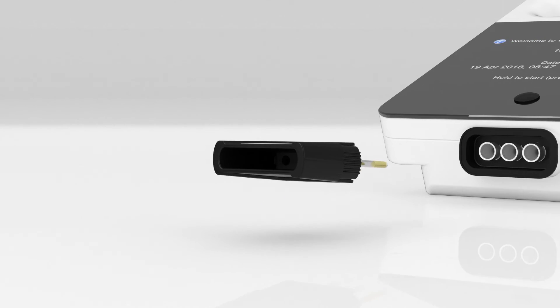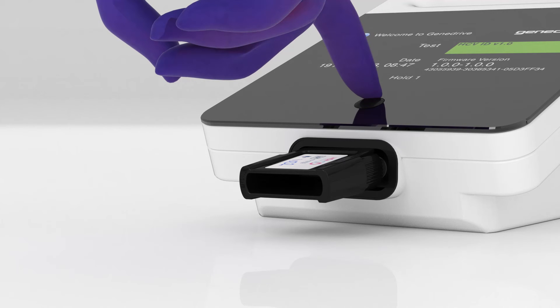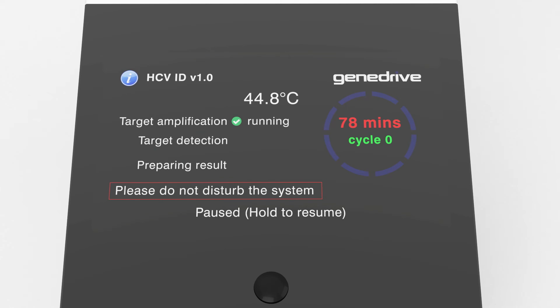Place the cartridge into the GeneDrive instrument. To start the plasma preparation reaction, press and hold the function button until a beep is heard. The reaction will take approximately 10 minutes to complete. During that time, GeneDrive heats the sample to 37 degrees Celsius for 5 minutes and then 95 degrees Celsius for 5 minutes. During this step, the plasma proteins and viral particles digest, which releases the viral RNA.